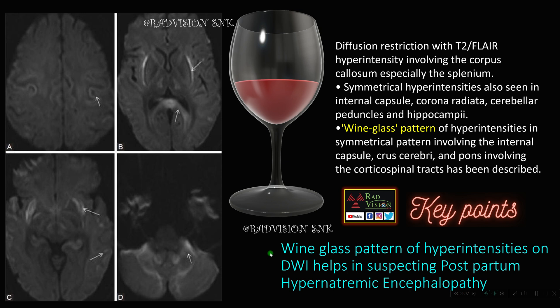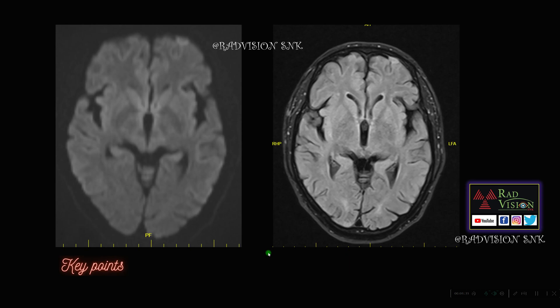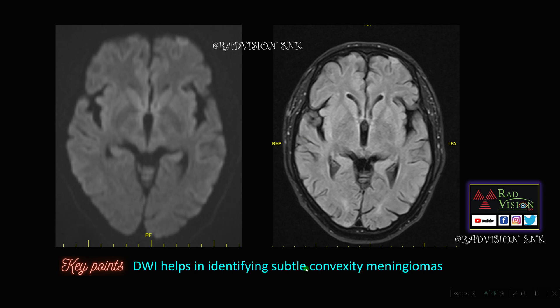Next case: here you can see there is restricted diffusion on DWI in the left frontal lobe convexity. On FLAIR images you can see there is an extra-axial lesion. Diffusion weighted imaging also helps in identifying subtle convexity meningiomas. Sometimes convexity meningiomas can be missed on routine sequences, but look for any restricted diffusion on DWI in the convexity which may help in identifying subtle convexity meningiomas.